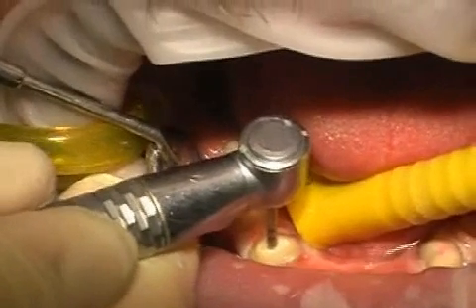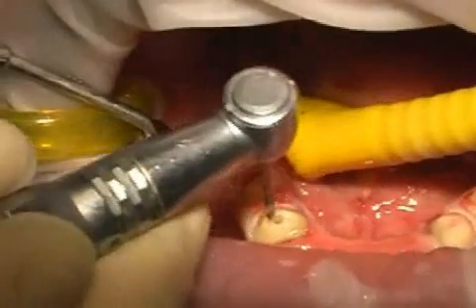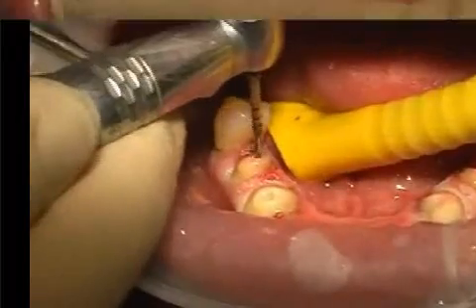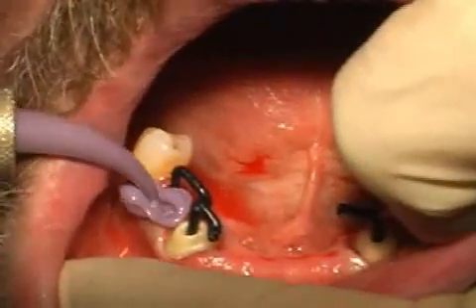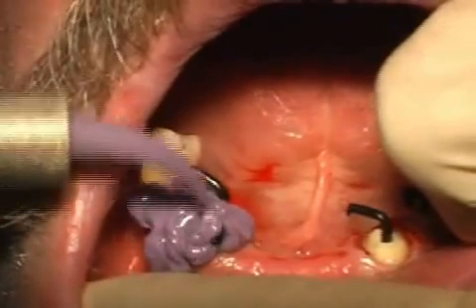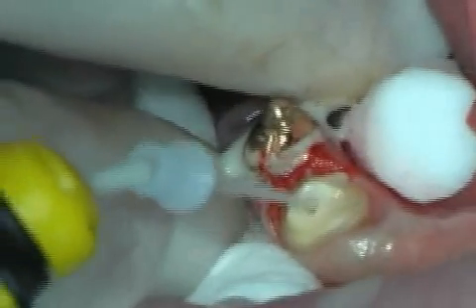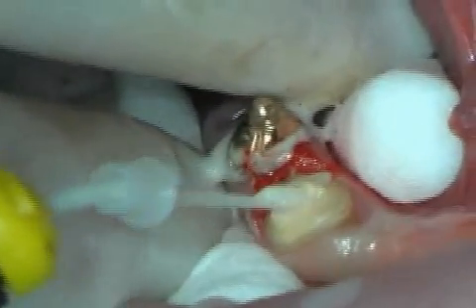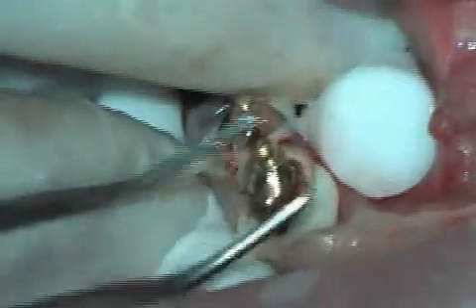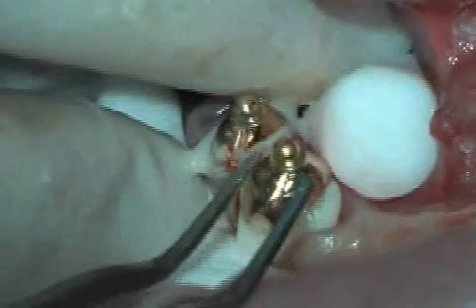And now back to pivot forming. The film shows how a part of the root filling is removed or hollowed out after root treatment. Then an imprint is taken, and the dental technician is shown the position and form of the hollowed out areas using the black pins. Now the technician can produce the individual metal pivot, and a week later the pivots, in this case root pivot caps, are cemented in. The holders are set into the denture, which greatly improves the stability of the denture.